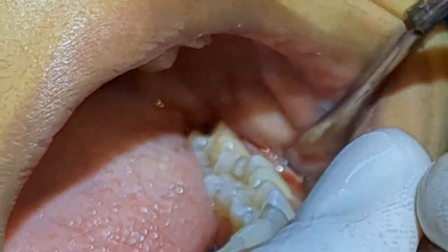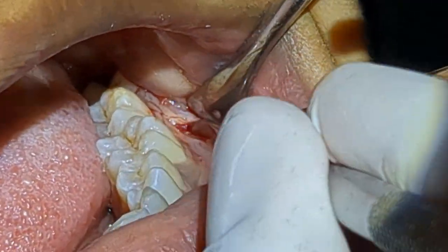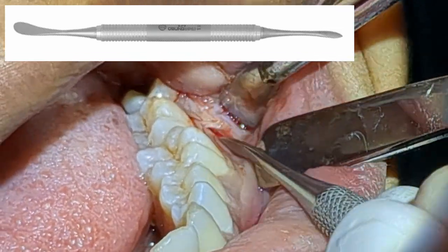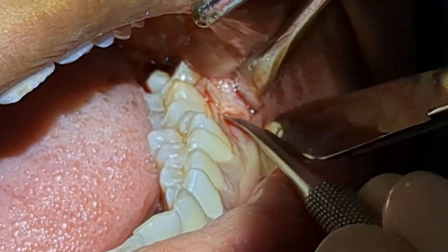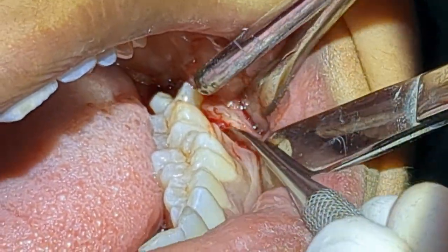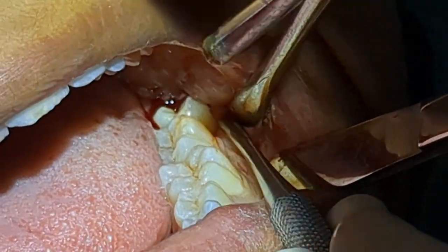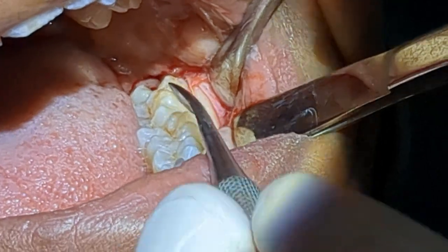You can see that because of the local infiltration I did for the incision line, there is very minimal bleeding. Now I'm going to push the pointed end of the periosteal elevator under the periosteum — as the name suggests, a periosteal elevator. You can see the bone being exposed, and now I'm separating the periosteum from the bone.